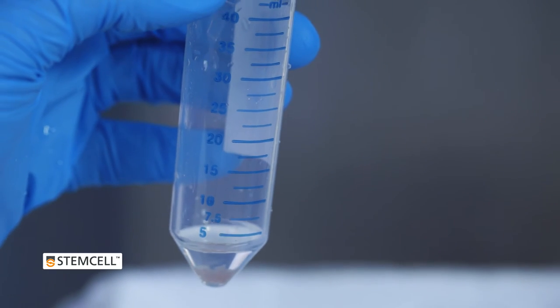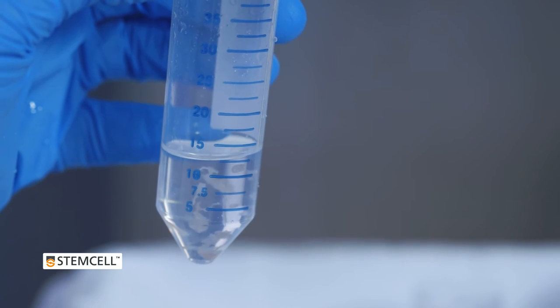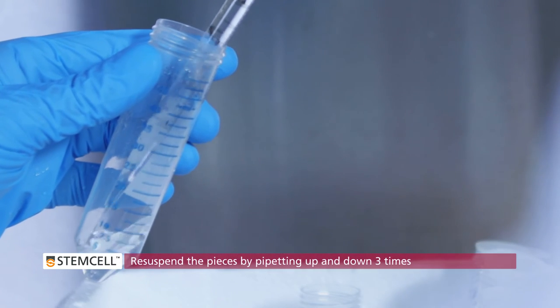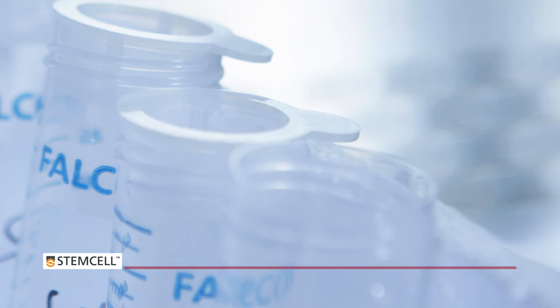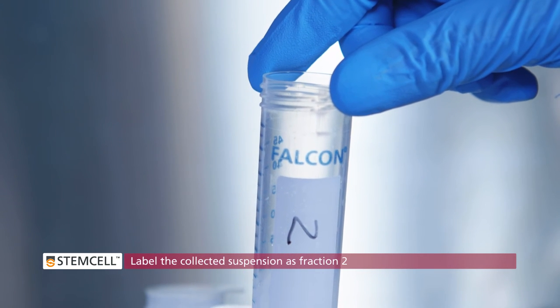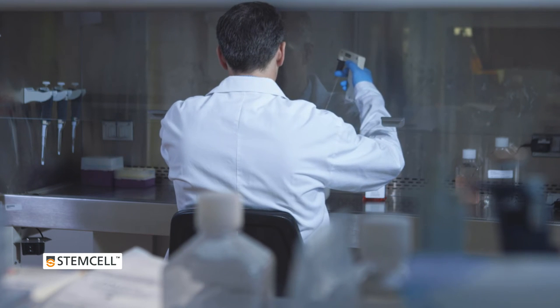Add 10 mL of fresh PBS plus 0.1% BSA to the conical tube containing the intestinal pieces. Resuspend the pieces by pipetting up and down 3 times, allow the intestinal pieces to settle, then collect the supernatant and pass through a new 70 micrometer filter into a new tube. Label the collected suspension as fraction 2. Repeat this process 2 more times to give fractions 3 and 4.